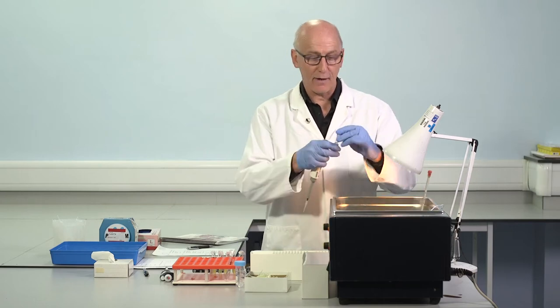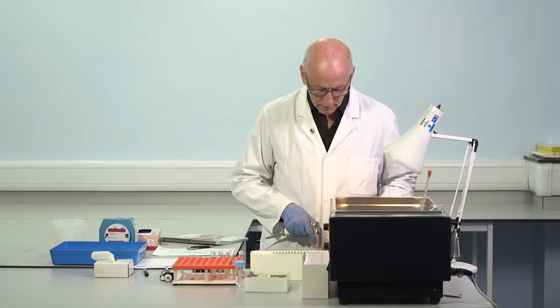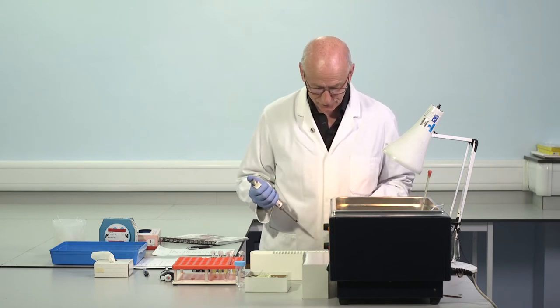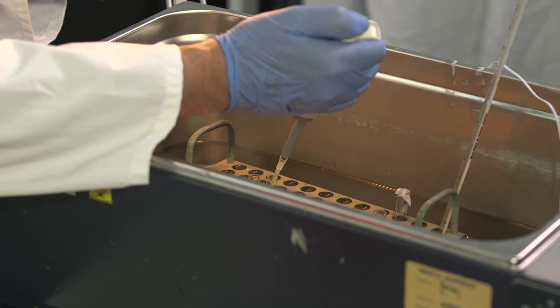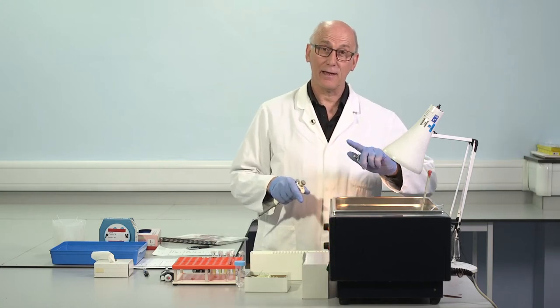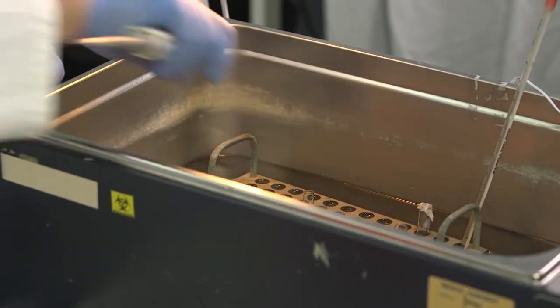Remember, we've got the calcium chloride warming to 37. The autoanalyzer, of course, times this automatically. Working in the water bath, we have to do this visually. So we're now at 3 minutes. Same volume, 100 microliters, calcium to the first tube and mix. At 15 seconds, remember that we added activator, APTT reagent, 15 seconds later, exactly 15 seconds, second tube and mix.